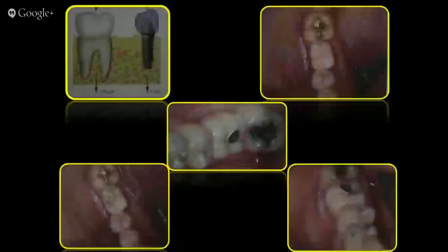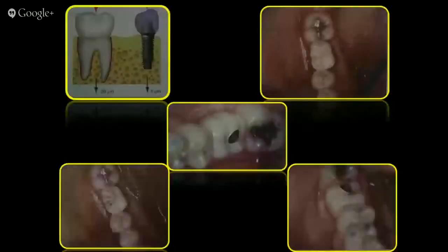So the key is that in gentle tapping, I do not have any contact on the implant restoration, because it's my natural teeth which take the contacts. And in heavy biting, I am uniformly distributing the contact between my implant restorations, my natural restorations, as well as crowns and bridges on teeth. That's why I'm doing occlusal equilibration at step 1, the timing of occlusal contact.